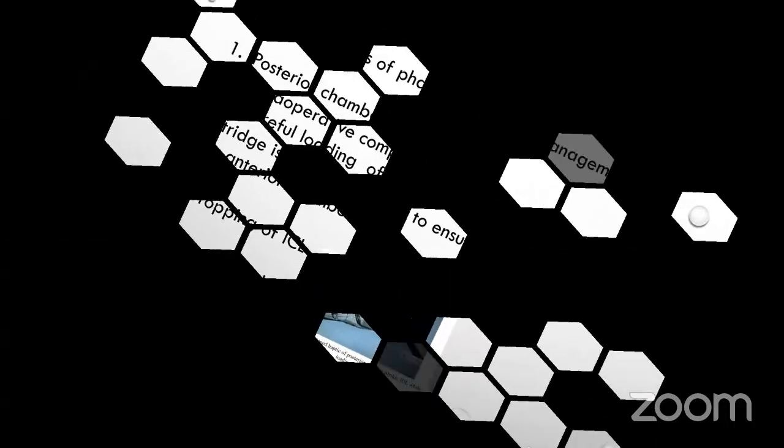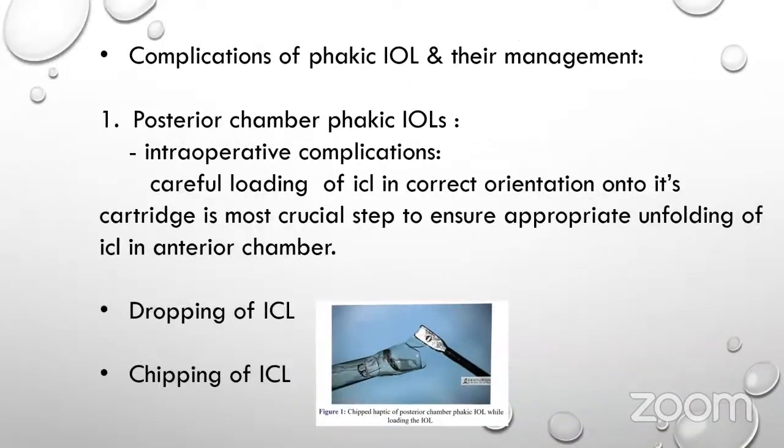Next. Complications of the phakic IOL and their management. Posterior chamber phakic IOLs, intraoperative complications.